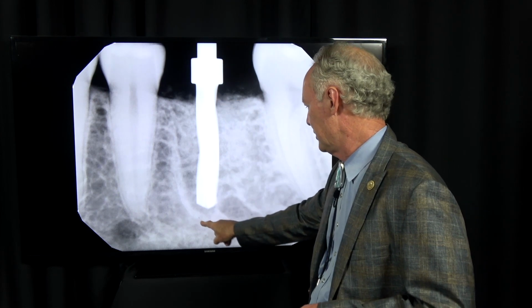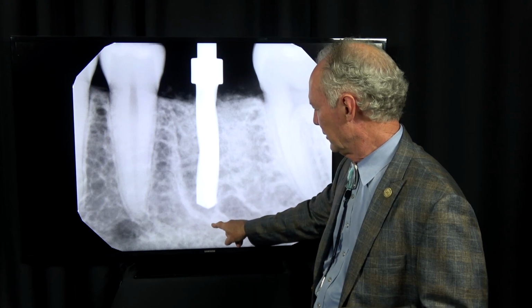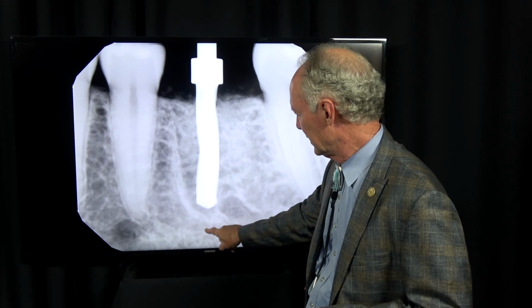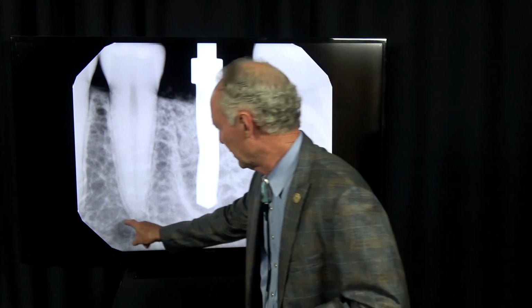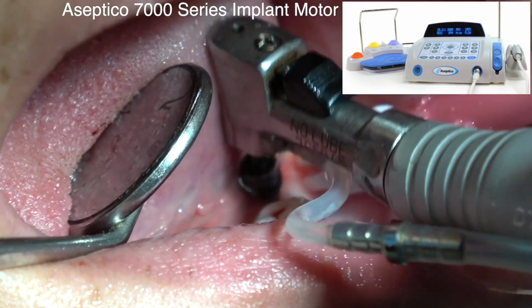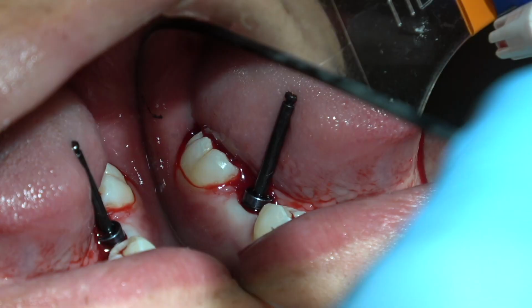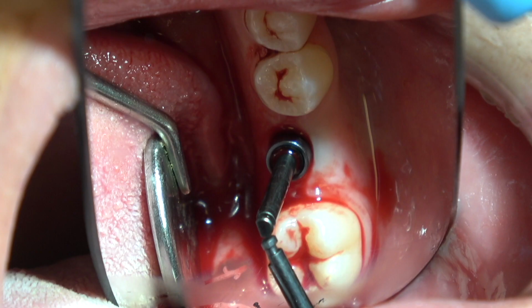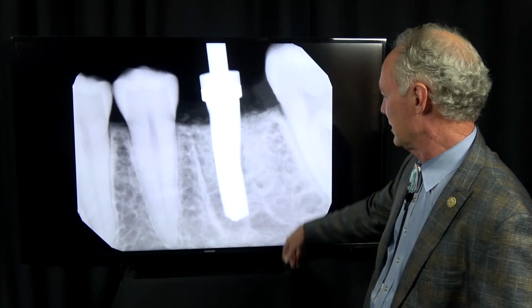And see, there's the tip of the root. So I'm not worried about the inferior alveolar nerve because it's apical to the tip of the root. There's the mental foramen on the second bicuspid. So I'm in good shape, and it's parallel to the adjacent teeth. Perfect is my favorite word. You don't get it perfect, but you're trying to. So this is good and parallel to the adjacent teeth.